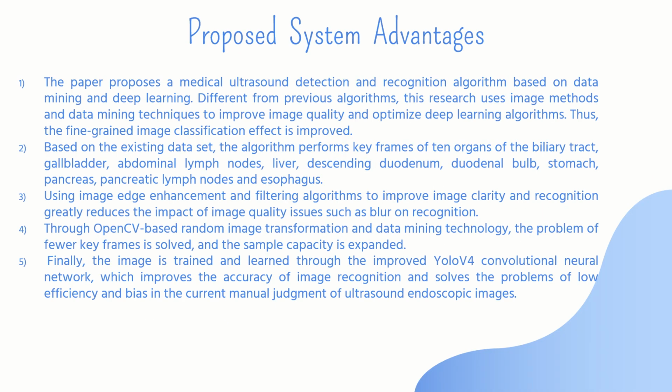Coming to the proposed system advantages, in this paper they have introduced a new algorithm for recognizing and detecting ultrasound medical images. Unlike previous methods, the main target and goal in this research paper is to improve image quality and optimize or enhance deep learning algorithms.